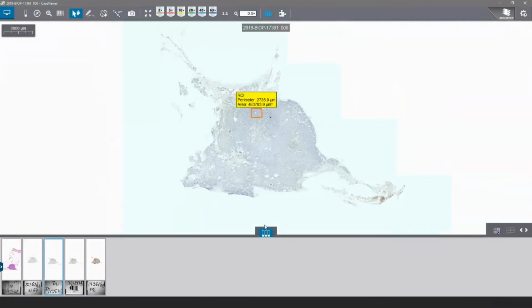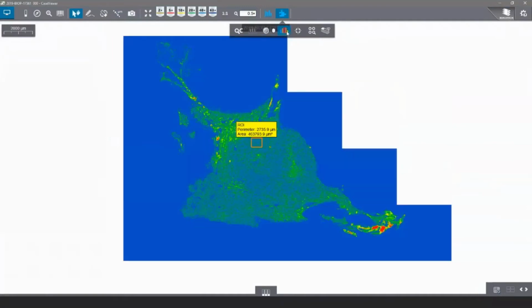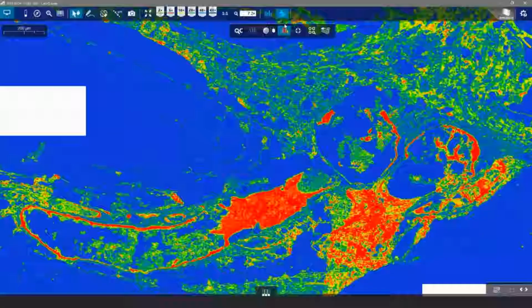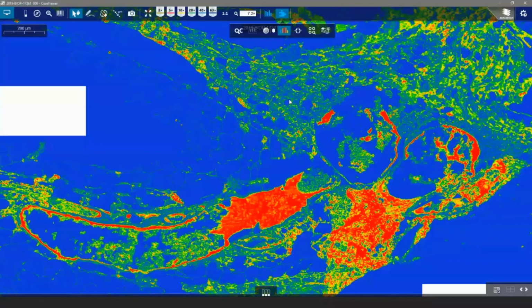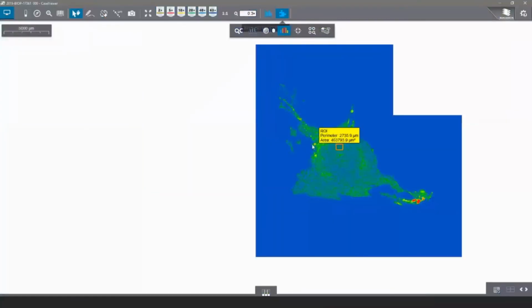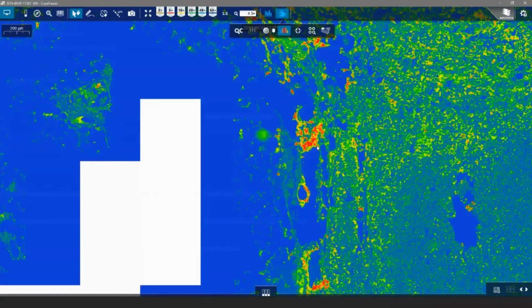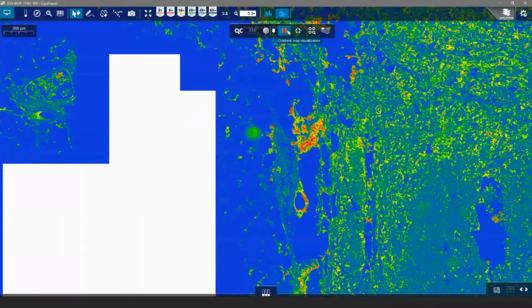On this slide, if we would like to see quickly where is the strongest diaminobenzidine stain, we can use this and we can see instantly that here there is something, so let's check it. Unfortunately, this is artifact, but still it's a stronger diaminobenzidine stain which is not present on the other parts of the tissue. As a proof of concept, I think this slide, by the way, is quite good to show you what is the main purpose of this little feature here.